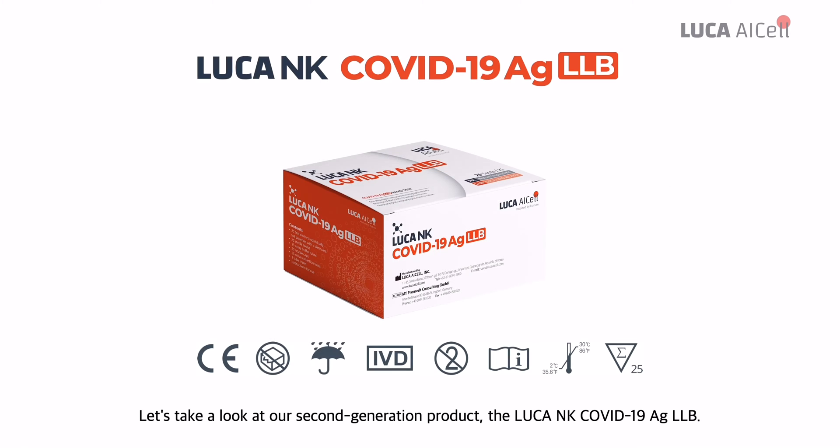Let's take a look at our second generation product, the Luca NK COVID-19 AGLLB.